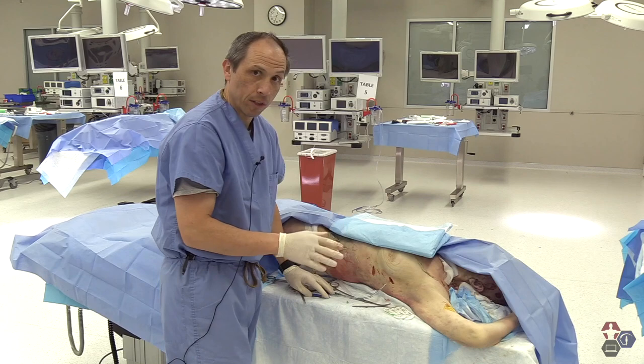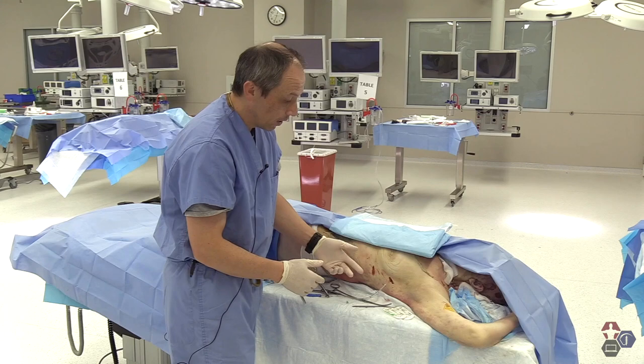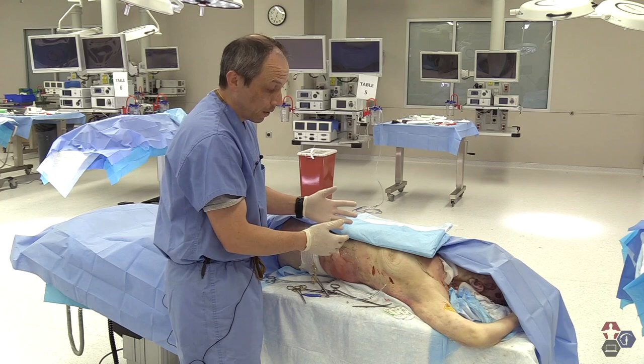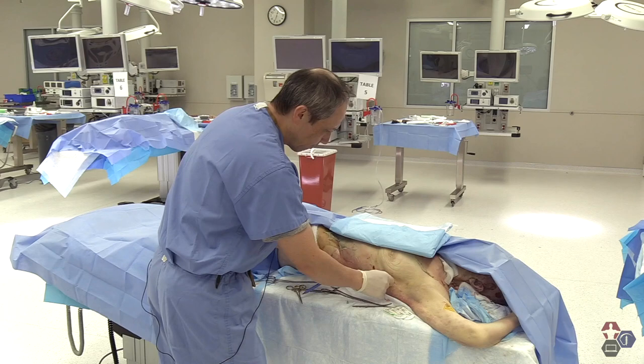A chest x-ray is the most definitive way of knowing the chest tube is in place. But here at the bedside, you can quickly have some indications. One is going to be fluid coming out of the tube or maybe some small areas of blood. Two, you will see fogging in the tube. Three, there may be increased or better respirations and more symmetrical expansion of the chest.